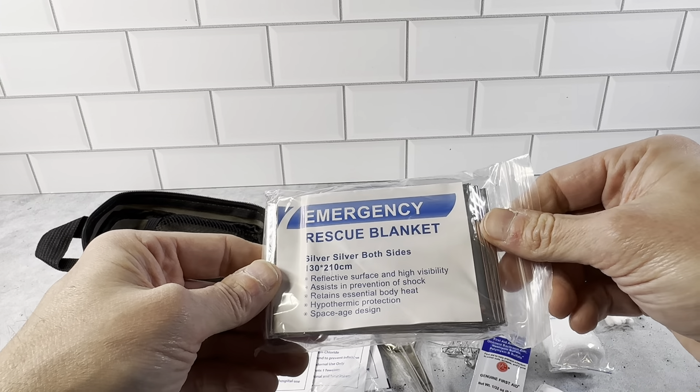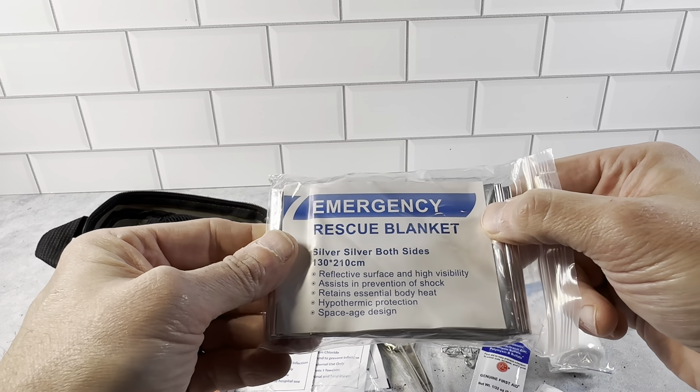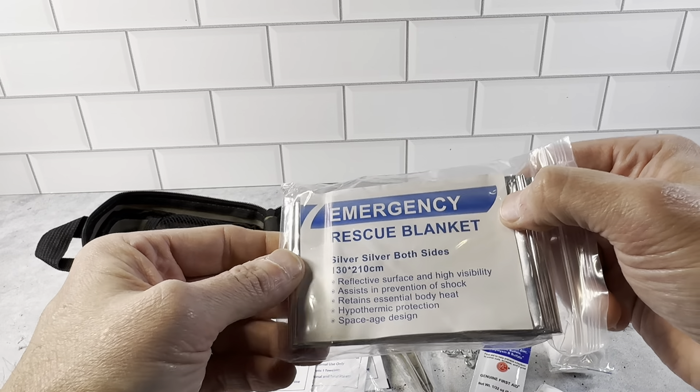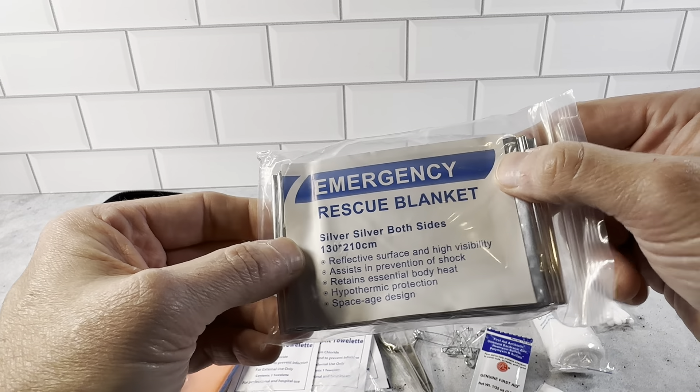You have the emergency rescue blankets — silver on both sides. These are to keep you warm. Reflective surface, highly visible. Assists in prevention of shock, retains essential body heat. Hypothermic protection. Space age design.